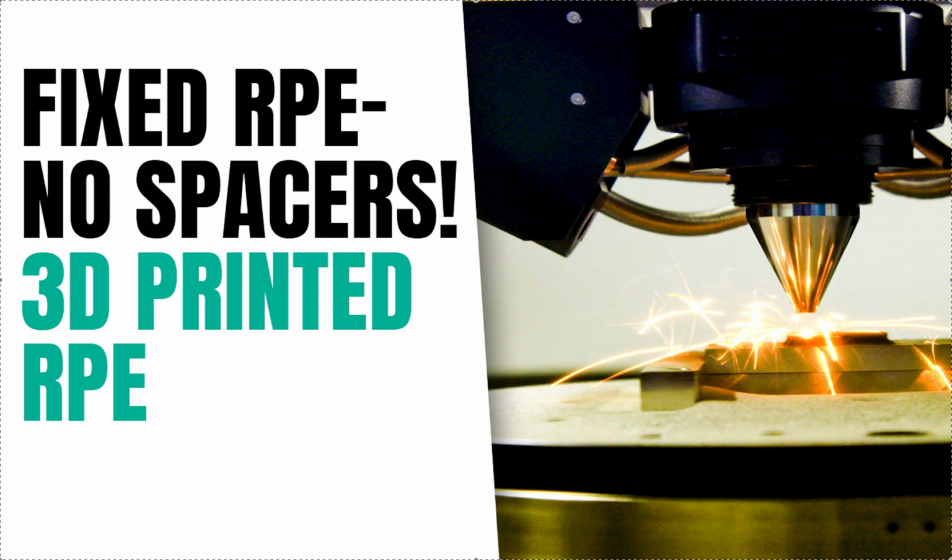So price point, I would say, is about 25 to 30 to 40% more than a traditional expander. That gives you some idea on the cost, but you shouldn't have as many remakes or anything. So I think that's good. And you can eliminate the spacer appointment for someone who wants fixed. So I think there's definitely a value in that, but not all the labs do it. So you're gonna have to search out and see who does it. So again, this is a 3D printed expander.